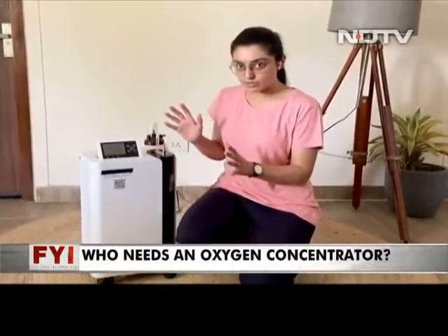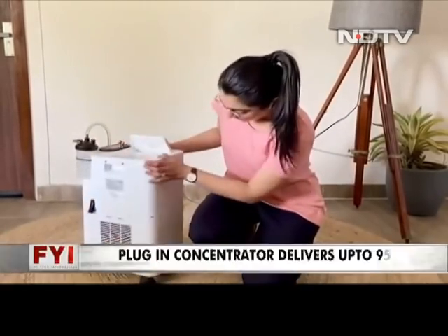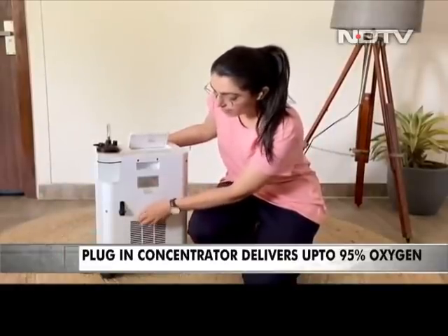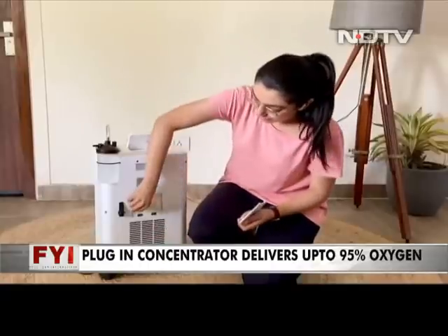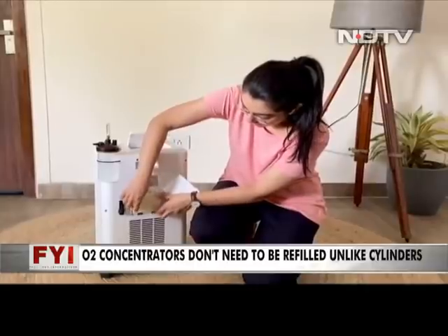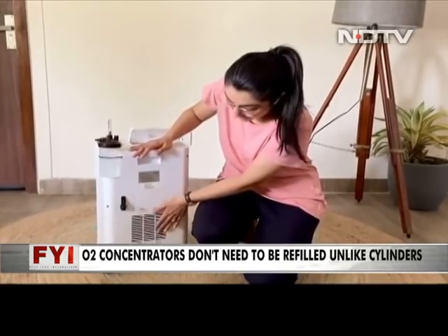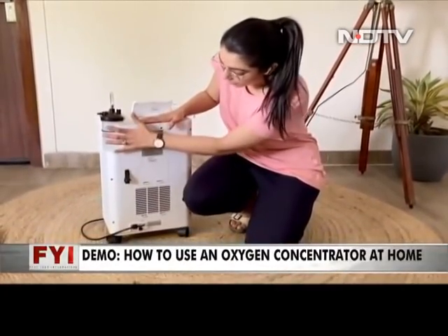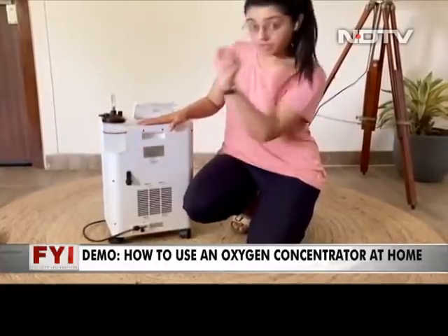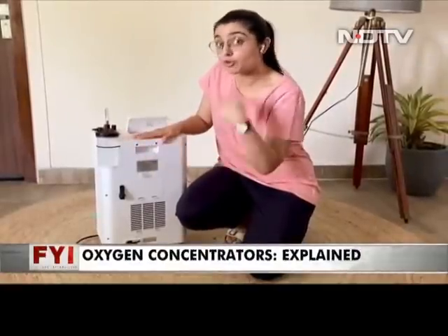Now a few basics to look at once you have one. I've plugged it in, and then there are two key things. There are two filters that will come. If you're unboxing a new one, it will come with a set of filters. I've recently replaced this one, so it's absolutely clean. There is one over here. There's one over here as well. And then there is this bottle that needs to be filled with water. It has a maximum marker written on it. Ensure that you're not going above that because it needs a bit of bubbling. When I put it on, you'll know what I'm saying.